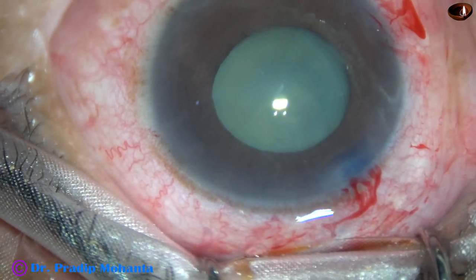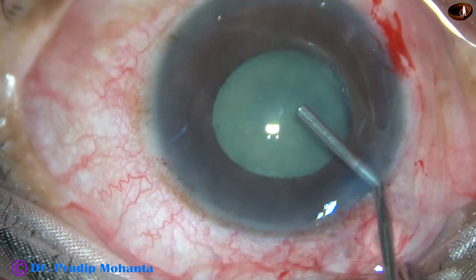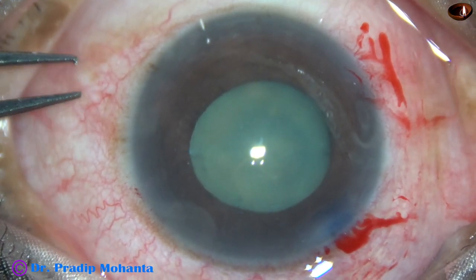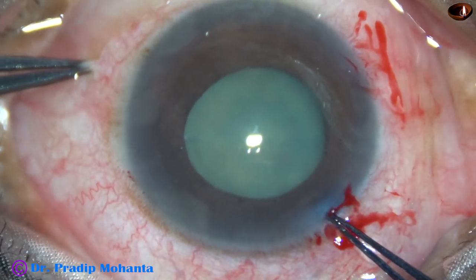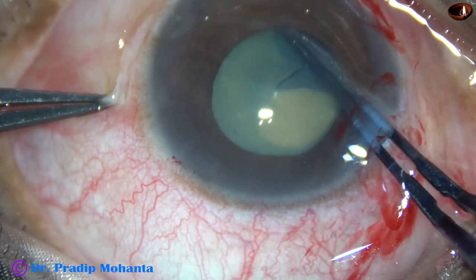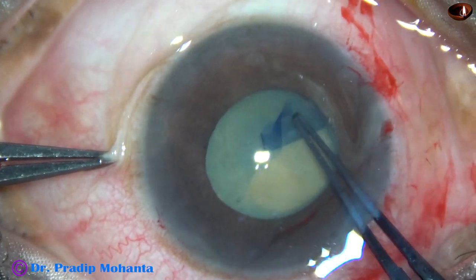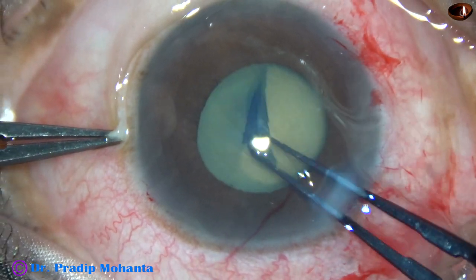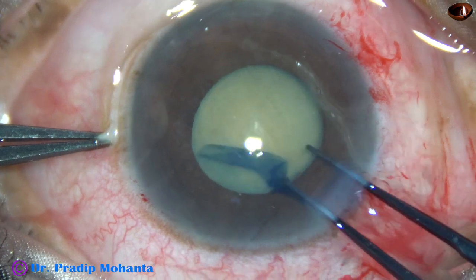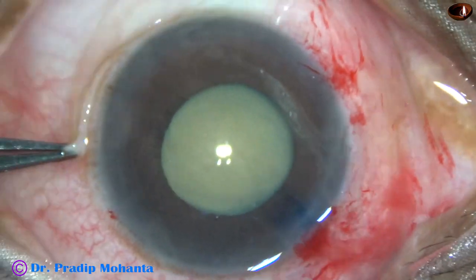Now I am going to do a rhexis with this utrata forceps. Hold the capsular tag, and to get an adequately sized rhexis, I am going very close to the margin of the dilated pupil. The capsule is being guided anti-clockwise, and a very nice circular rhexis of about 5 mm diameter has been obtained.